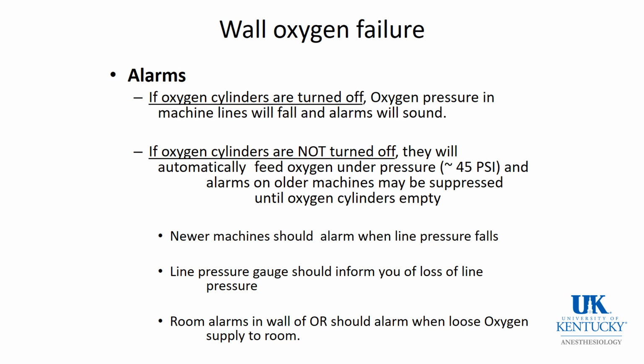On the other hand, if the oxygen cylinders are not turned off, they will automatically feed pressure into the machine, and in older machines, the alarms will be suppressed and you won't know about it until the cylinders are empty and the pipelines are empty. Now, the newer machines, I think, alarm whenever the line pressure falls, but be alert to that problem. Also note that there are alarms in the room when the room loses oxygen, and you should pay attention to that. Everyone ignores those alarms, but you should.